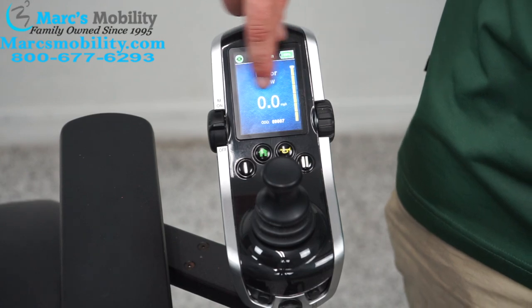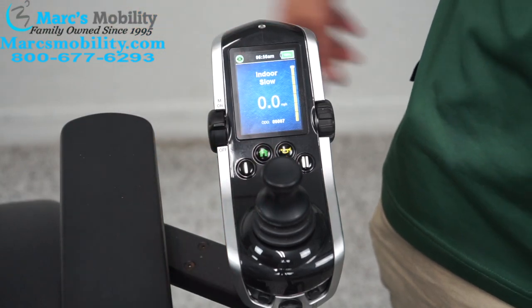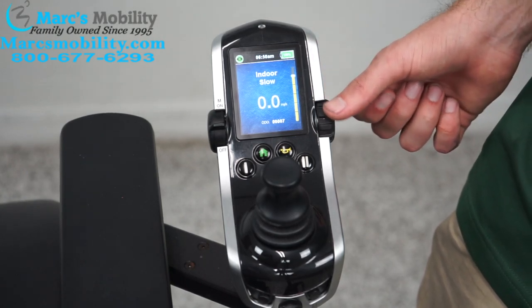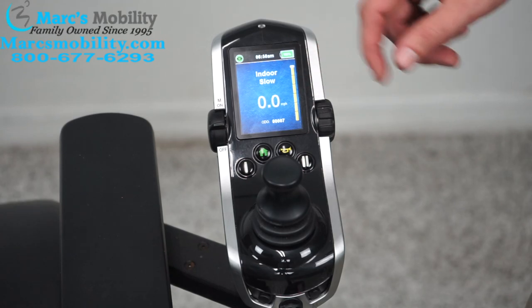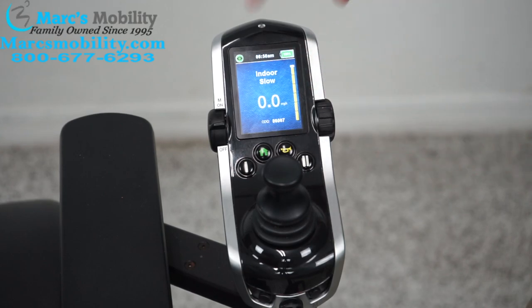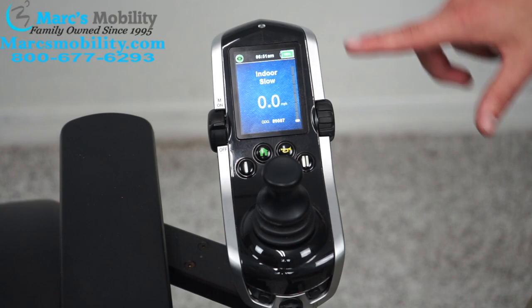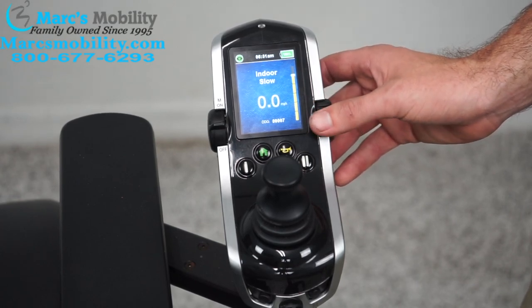You have your speedometer down here — I am at zero miles an hour. I pushed it forward and got 0.1 miles an hour, so it adjusts and tells you your speed. On the right-hand side is your speed control, so you can adjust the speed within each profile. On indoor slow the top speed is about one mile an hour with the gauge all the way up. If I drop it all the way down and push the joystick forward, it might go a quarter mile an hour. So you can adjust the speed within the profile as well.